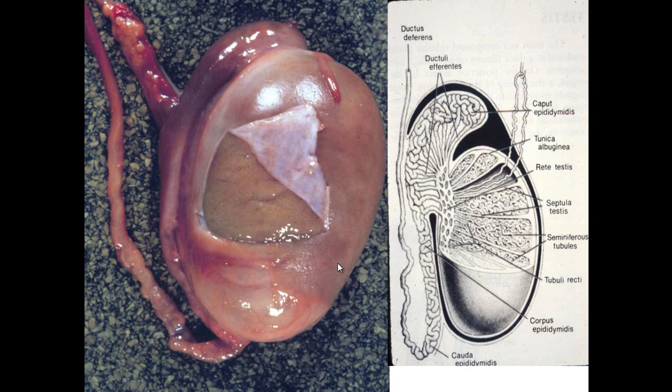goes to the outside. And here is the human testis, where you can see the tunica albuginea, or white coat, has been reflected back. Inside there's a series of tubes. These are the seminiferous tubules, and there is a capsule that surrounds the testis, as you see here and here, and from that it sends in some septa that subdivide the testis somewhat, not completely.